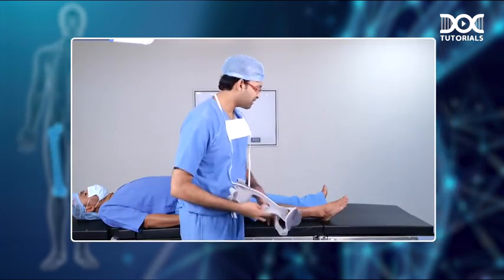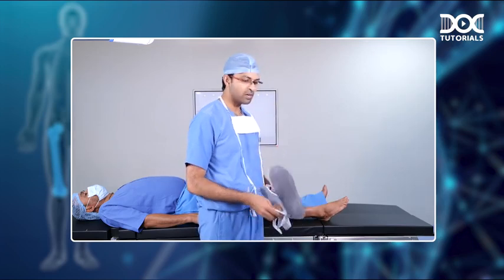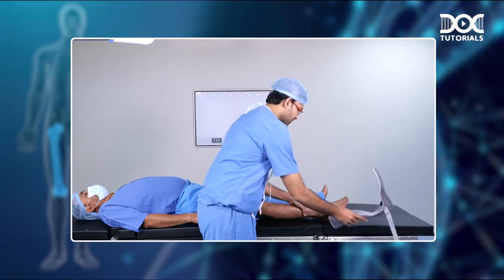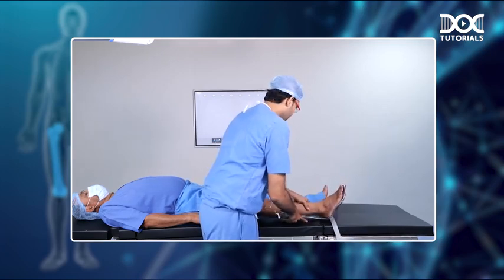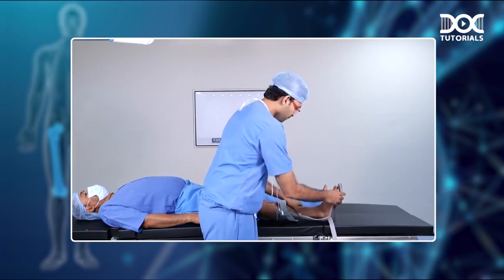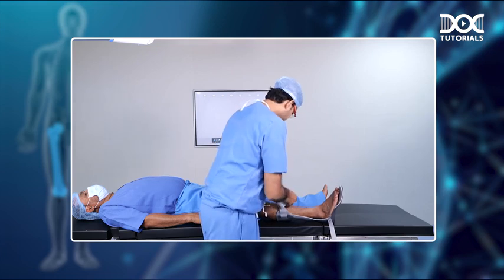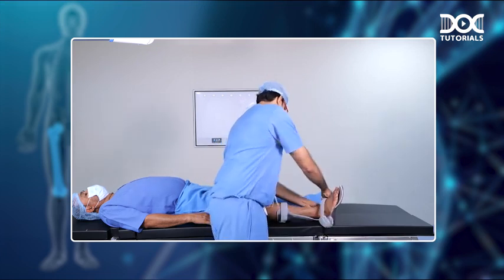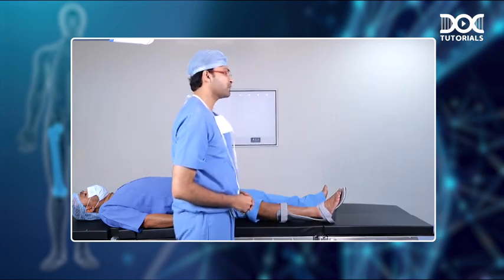So you can see that this patient has a foot drop here. He is unable to dorsiflex. So what we will do is that we give this supportive splint for the same. So this is a very simple splint. You keep the foot inside, like this, so that the foot will become dorsiflexed and you can just tighten the straps. This is the foot drop splint.